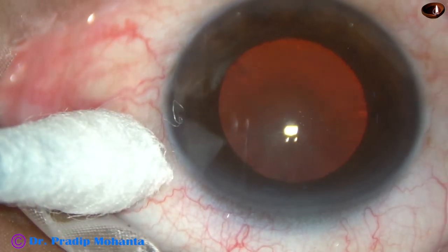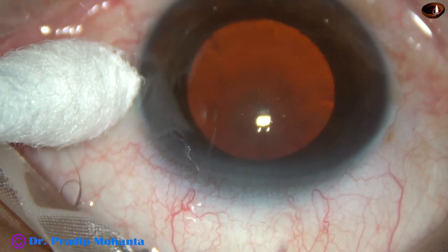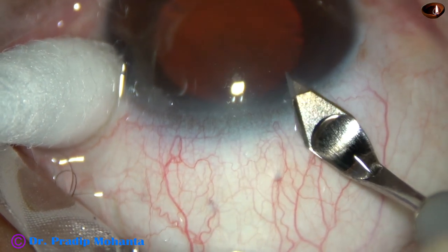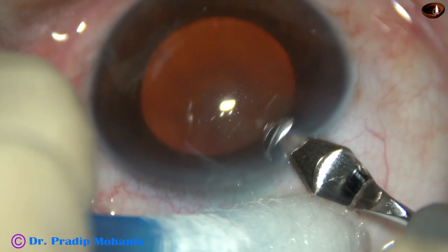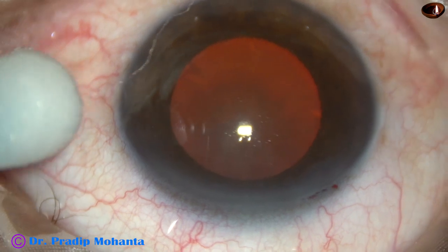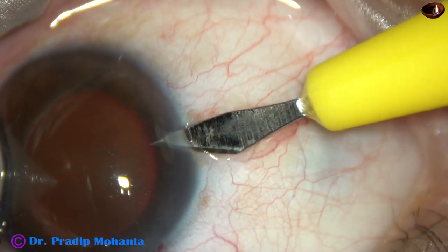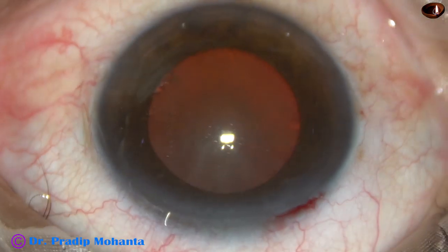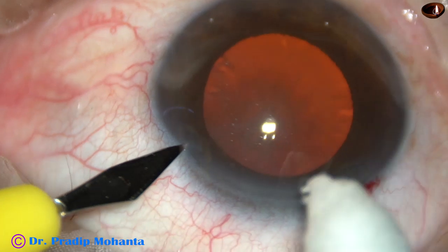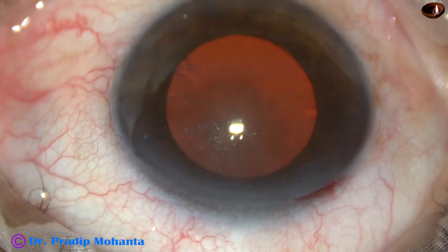The main incision is being placed with a 2.8 mm keratome at the middle of the limbus at around 11 o'clock. This is a side port on the right side of the main incision, and this is another side port on the left side of the main incision.